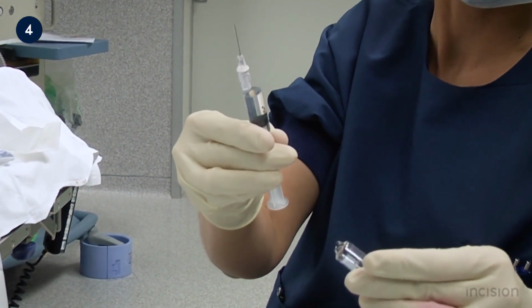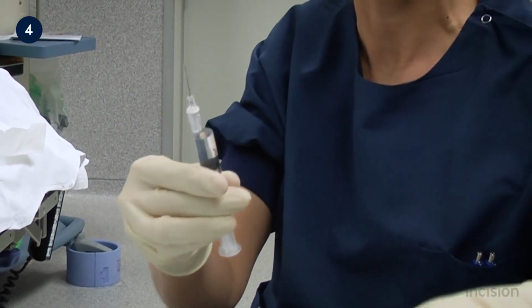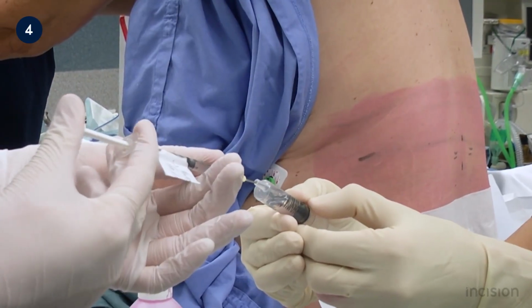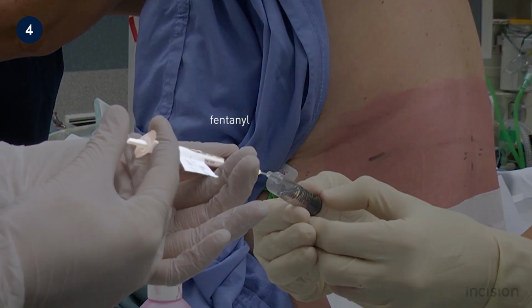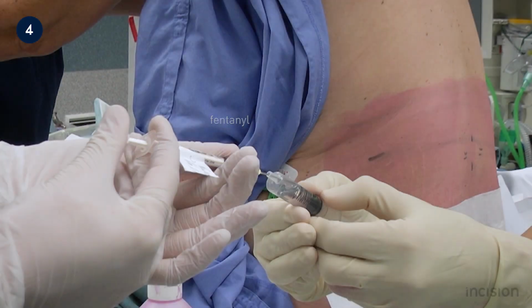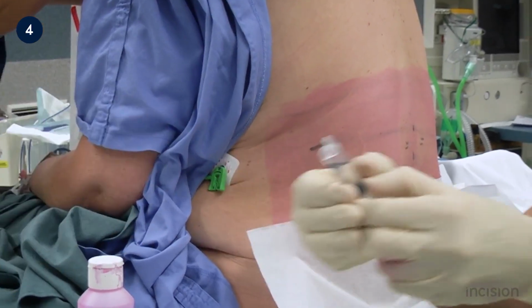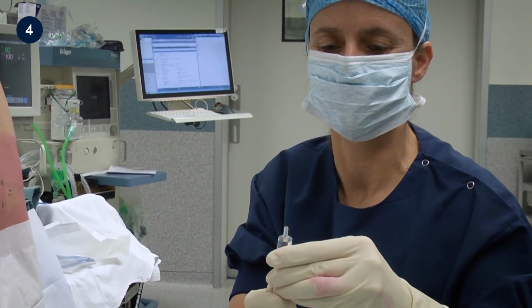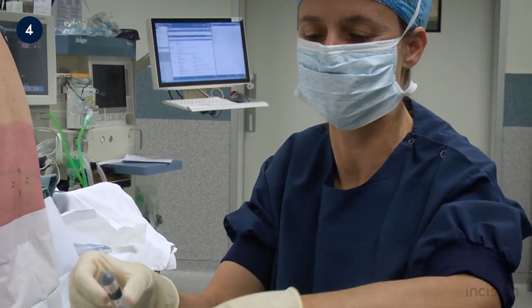For this case, the anaesthetist uses an additive in conjunction with the bupivacaine. Assisted by the anaesthetic nurse, fentanyl, an opiate, is added to the local anaesthetic. Additives potentiate and/or prolong the action of intrathecal local anaesthetics. They have their own side effect profile, and care should be taken when selecting the type of additive as well as the dose.